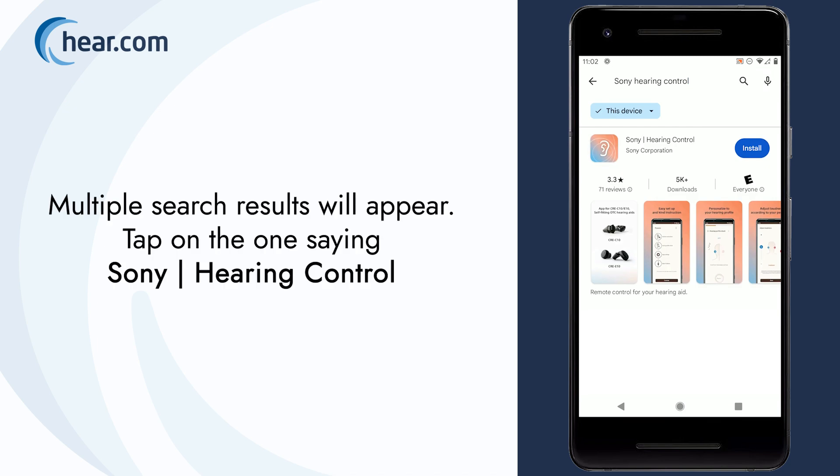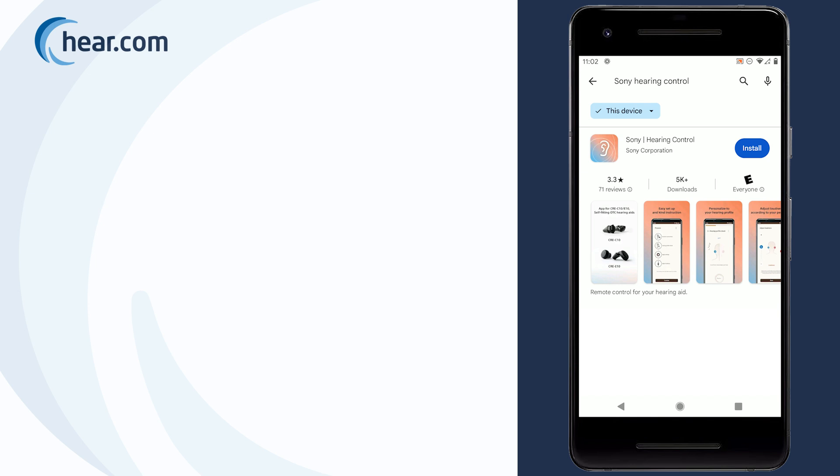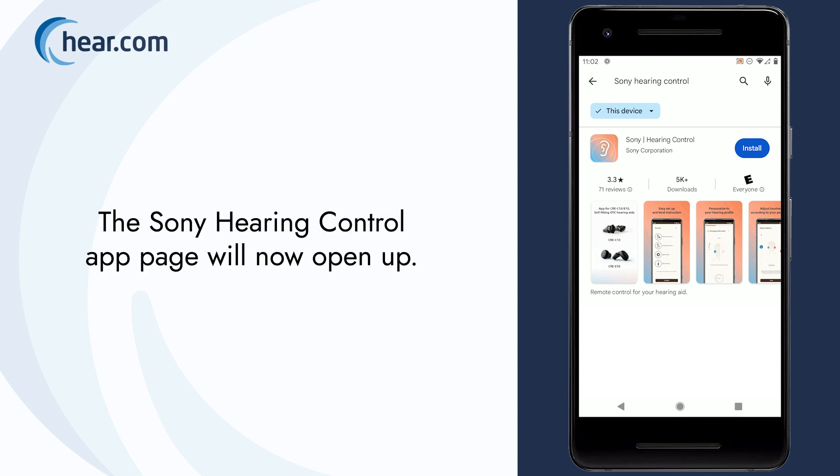Multiple search results will appear. Tap on the one saying Sony Hearing Control. The Sony Hearing Control app page will now open up.